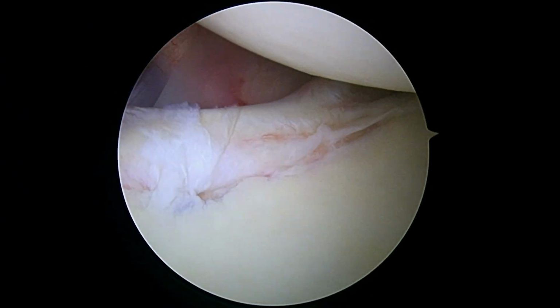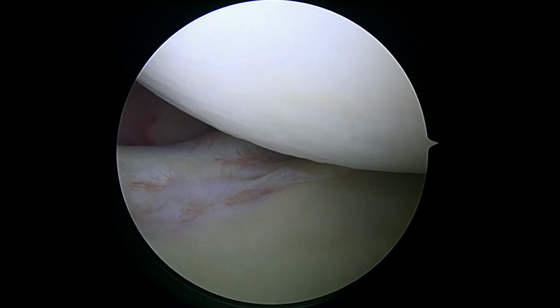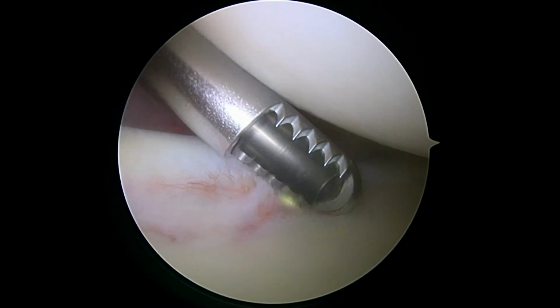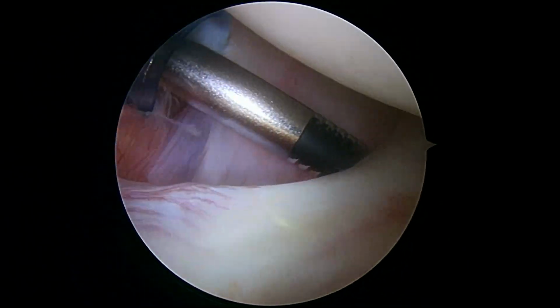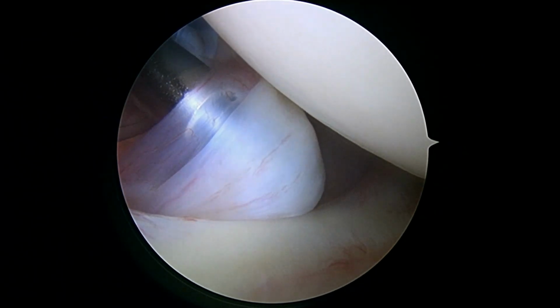You can look around the front of the shoulder. There's a little bit of fraying. I'll take that. A little bit of fraying on the labrum, but this is really just almost microscopic in nature right here. Not much to worry about. And then when we look down the front, here's the anterior band of the inferior glenohumeral ligament. There's the middle glenohumeral ligament right there.